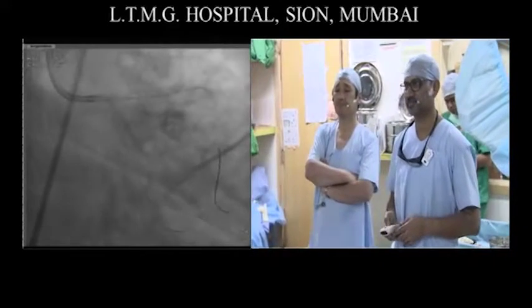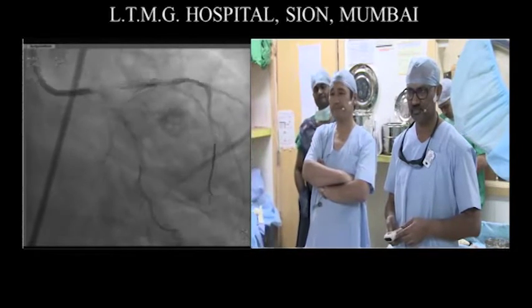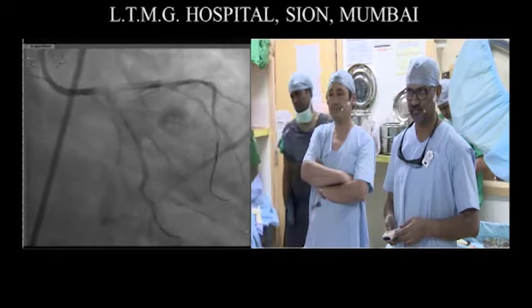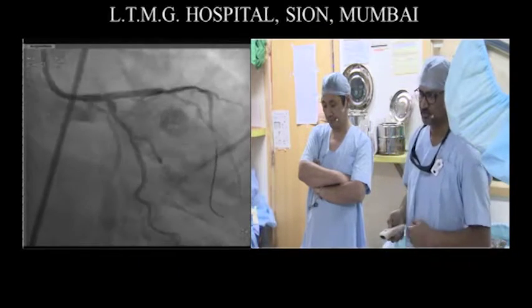Yes. So for the panel, there's a question earlier from the audience. Do you think BioMime having sirolimus-eluting drug, how do you feel about that as compared to the current generation everolimus-eluting stents?